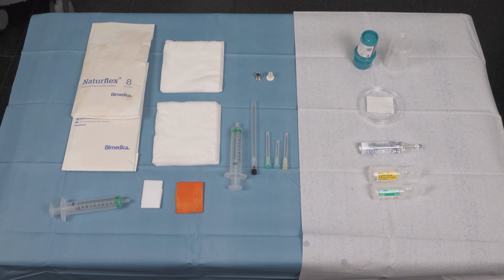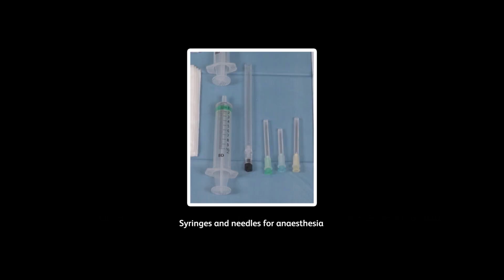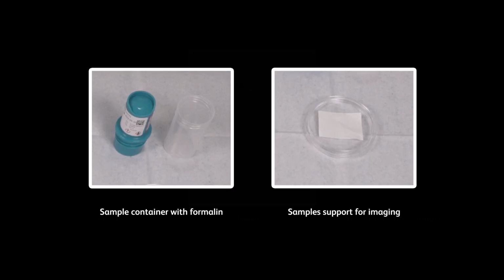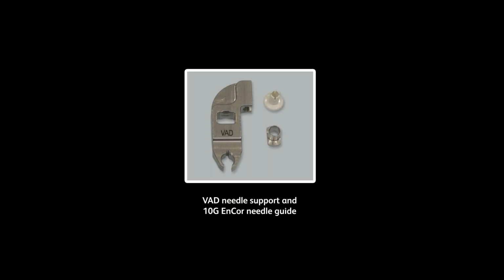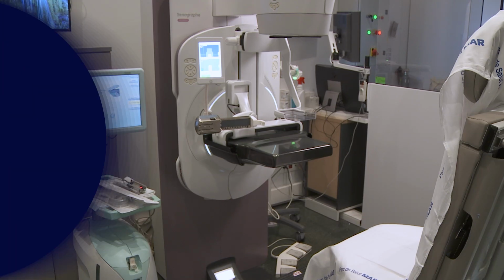All materials needed for the exam must be prepared in advance. Pristina Serena is set up for a horizontal approach, and the EnCor Enspire is ready for probe attachment.